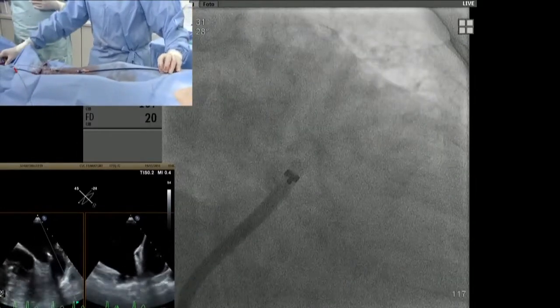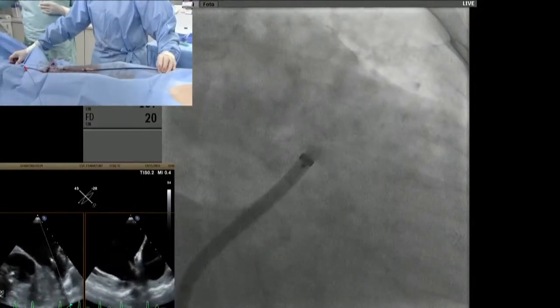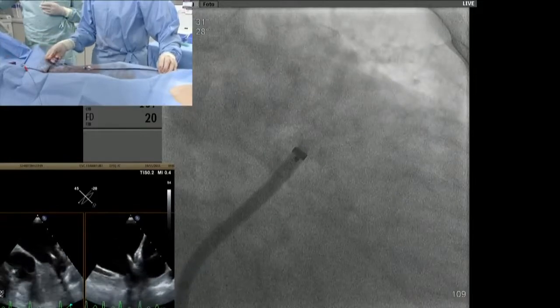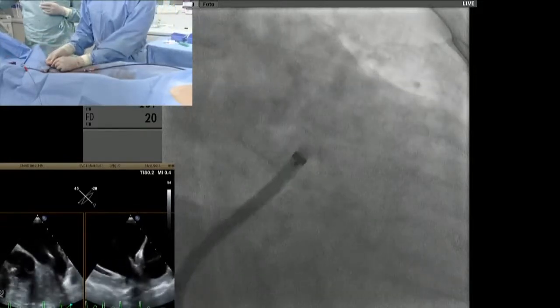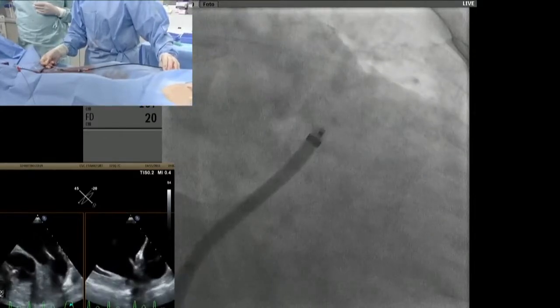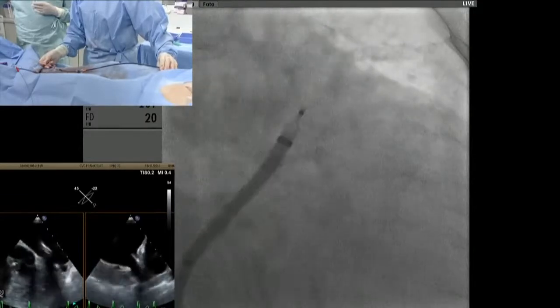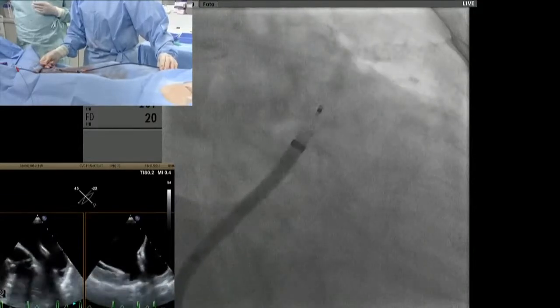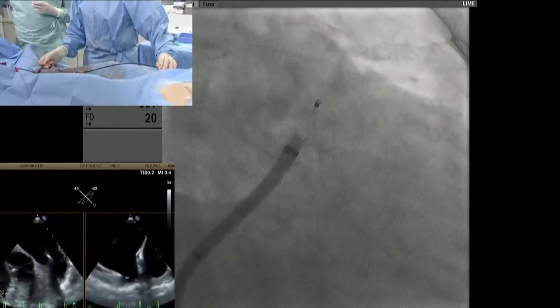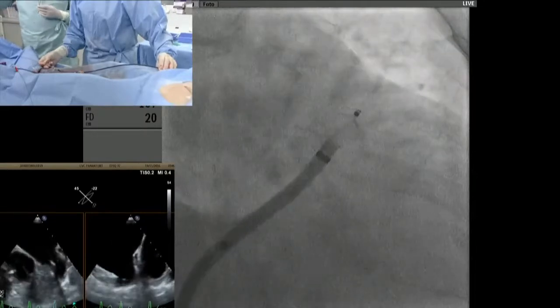This is very interesting. I just tried the 25, well, in a different orientation. Yeah. Deeper. The point was we should use the same orientation as we have now. It's not much different, actually. Let's. Yeah. Now it's far in.